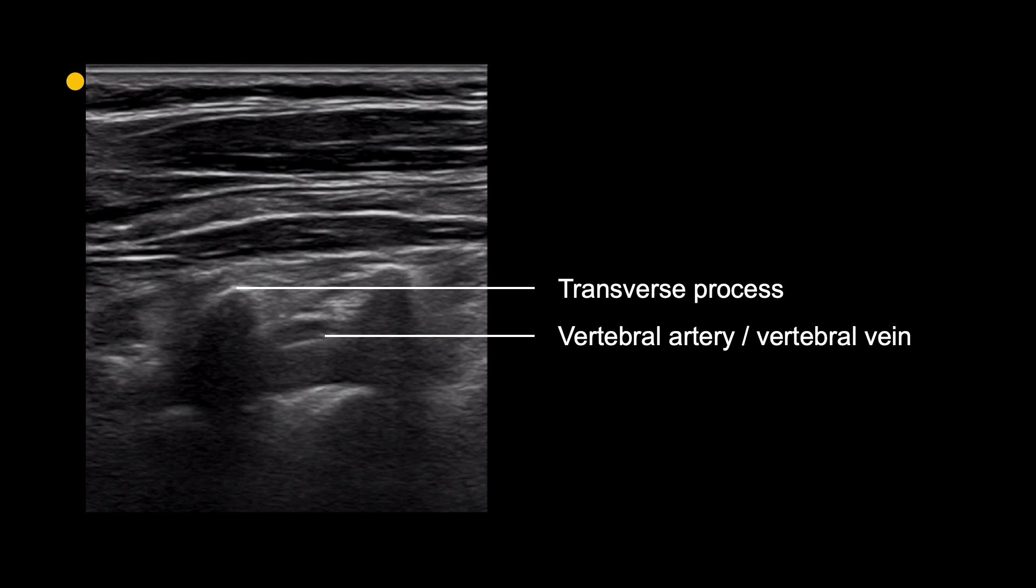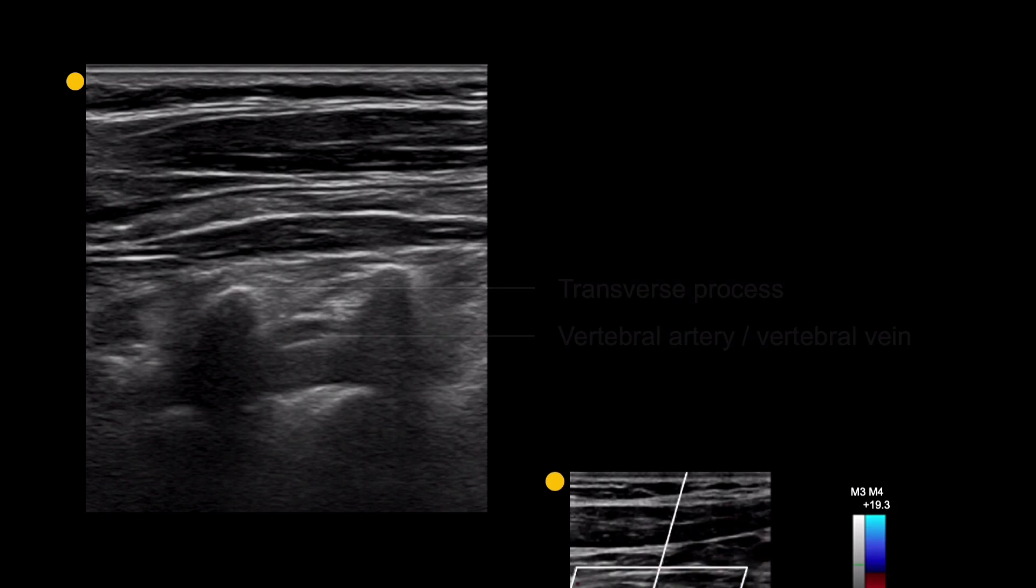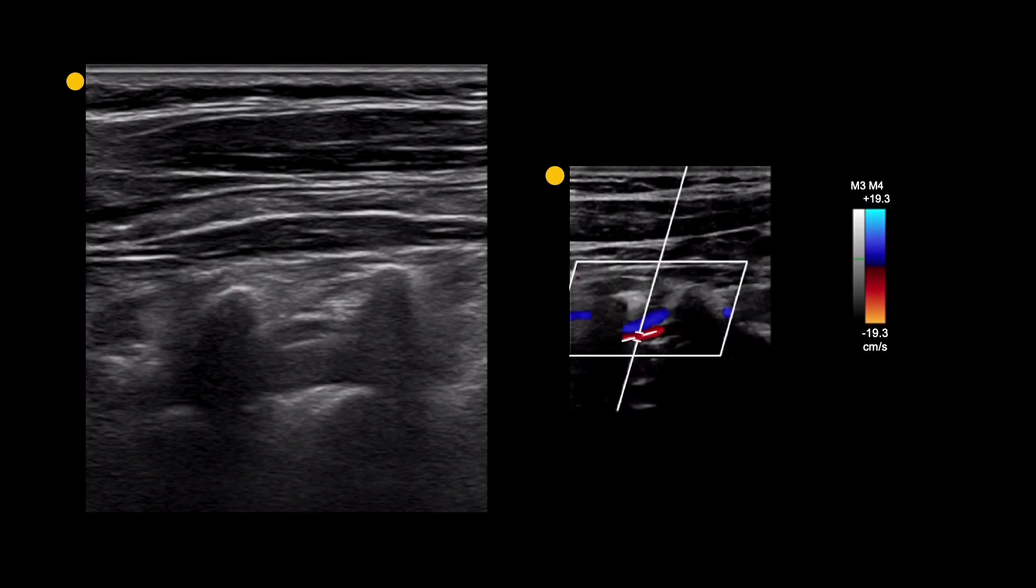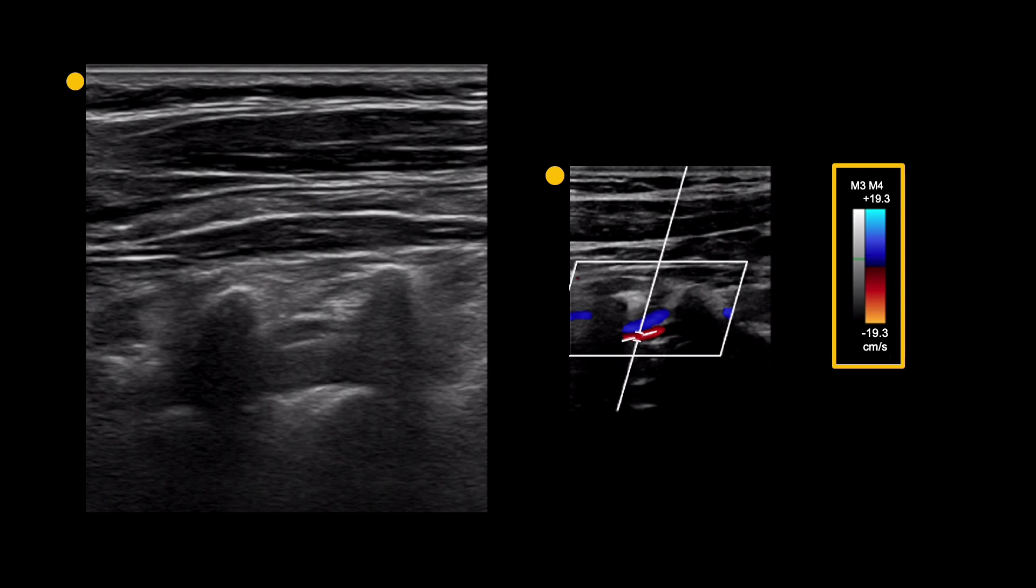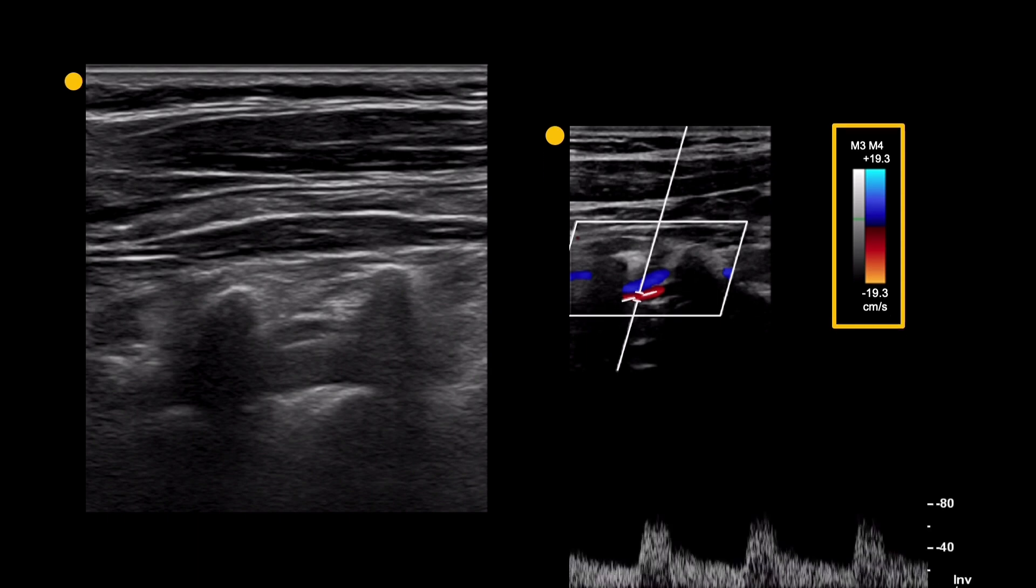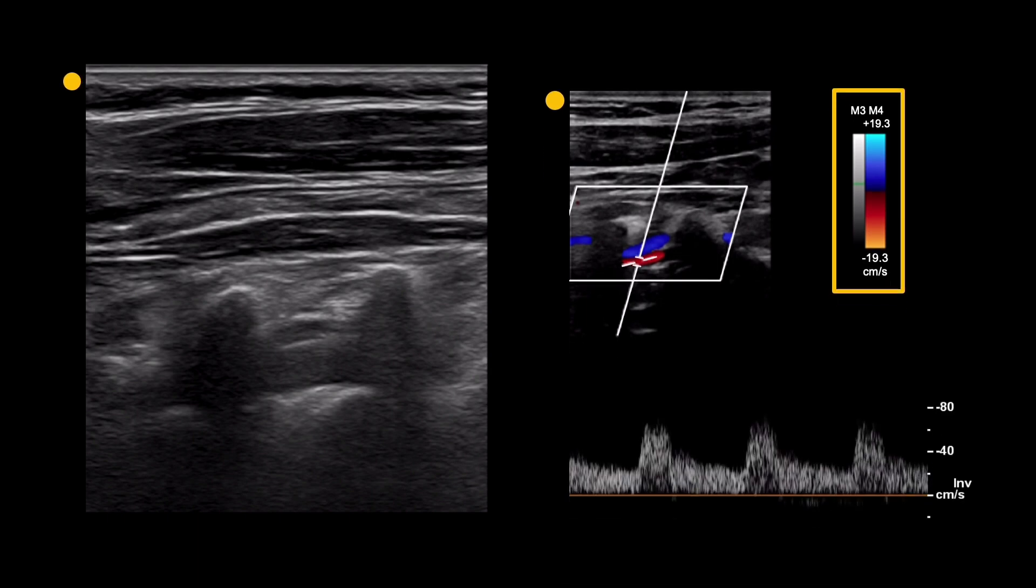The probe position should be adjusted to optimise the view of the vertebral artery. For the colour flow image, the colour scale will usually need to be reduced and the gain increased to get good filling of the artery, shown here in red. The vertebral vein, shown here in blue, will be seen just above the artery. A pulsed Doppler signal from the vertebral artery should also be obtained to confirm the direction of flow, which should be antegrade.